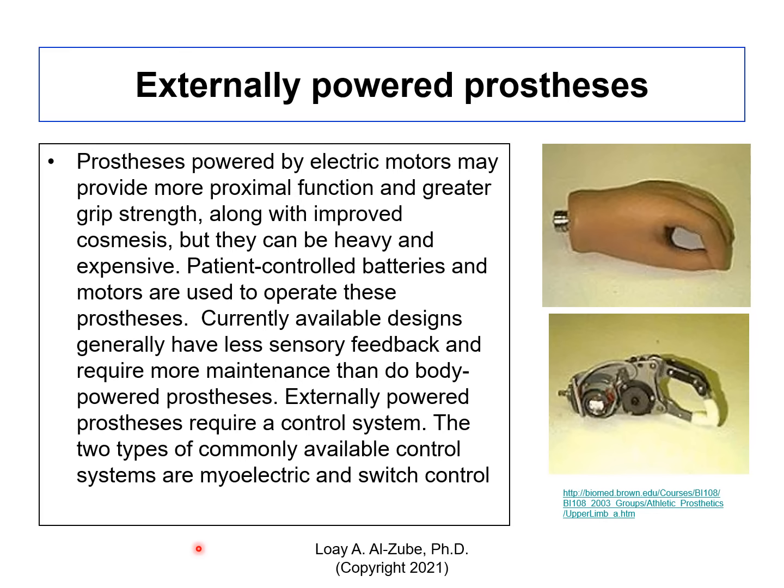And there are a lot of designs, actually. It's really an engineering problem, and creative solutions are available. And then we have externally powered prostheses. They use electrical motors, with more proximal function and a greater grip strength, and improved cosmetics.